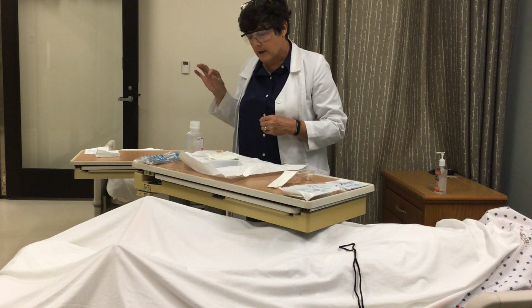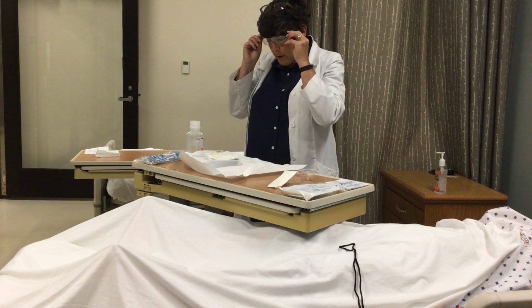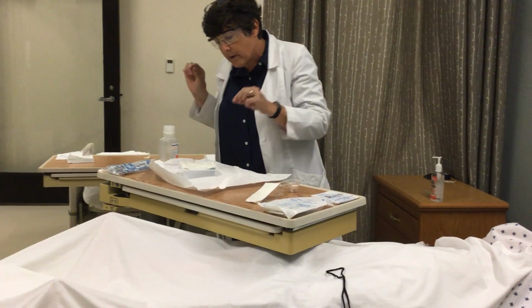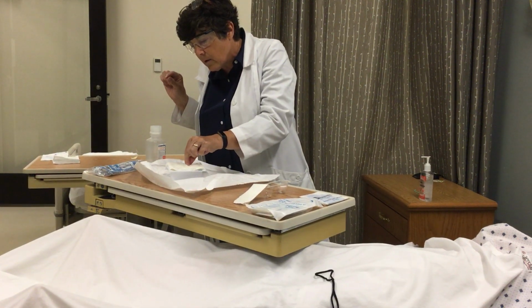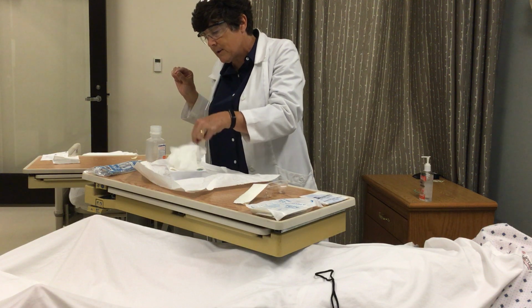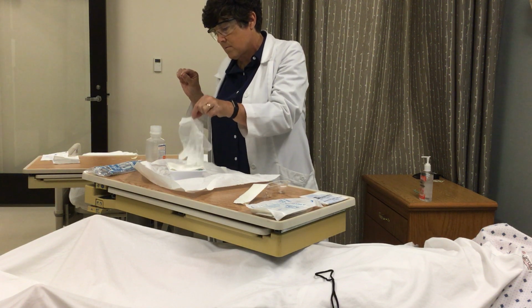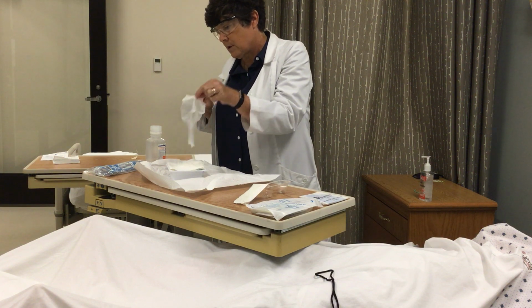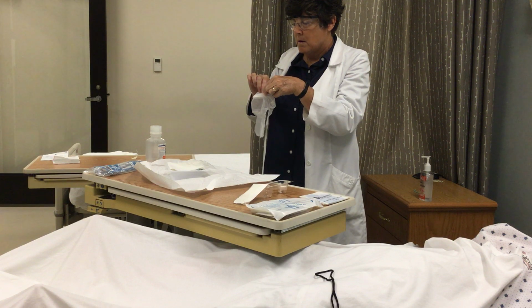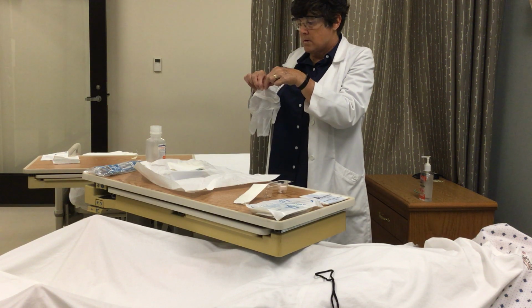The first thing on top of this kit are sterile gloves. I'm going to put on the first sterile glove so that I can set up my field. Sometimes it's easy, sometimes it's not. I'm going to put this on my dominant hand.